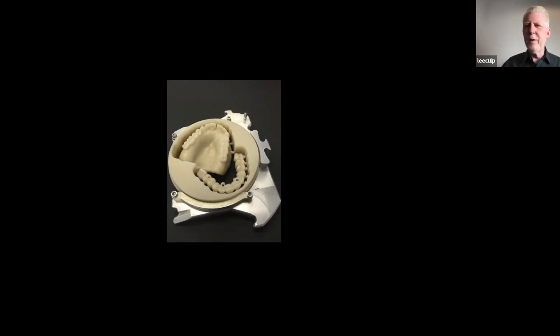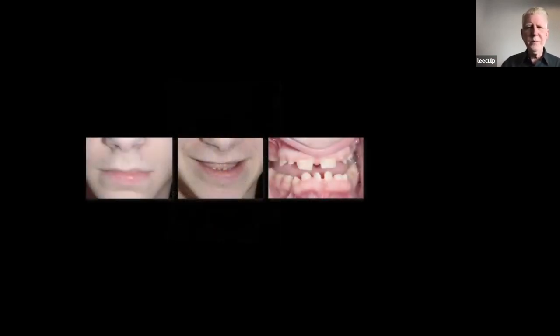You're just not going to do anything with them. I said, take that file, attach them to the base. I said, I don't care if it's one color, just attach them to the base. So then we started making dentures, milled dentures, but they were all one color, because you couldn't do anything other than glue in denture teeth, and I didn't want to do that.